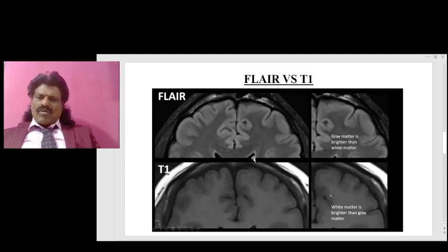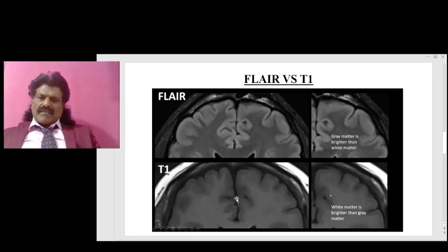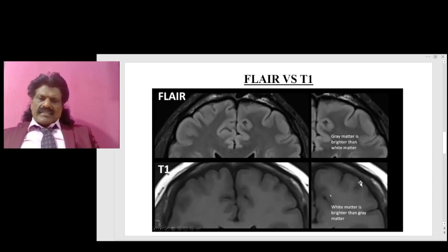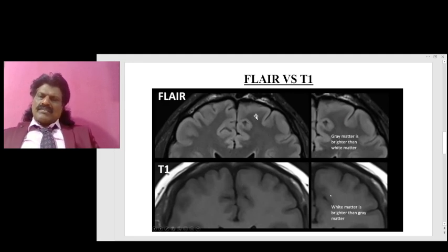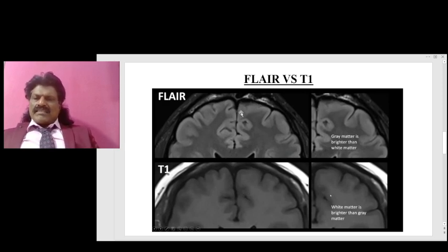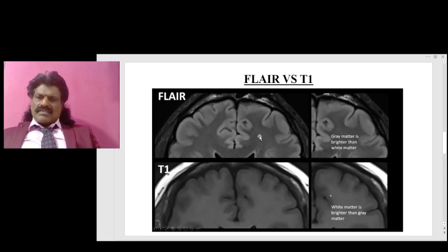By looking at the gray matter and white matter, we can differentiate whether it is FLAIR or T1, even though in both sequences the CSF is dark. In FLAIR, gray matter is brighter than white matter, whereas in T1, white matter is brighter than gray matter. This is how to distinguish between FLAIR and T1 despite both showing dark CSF.